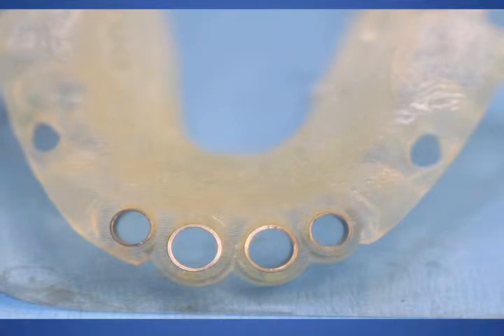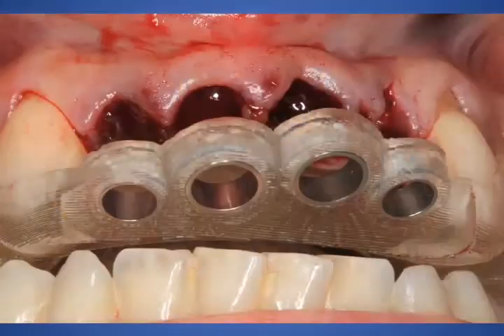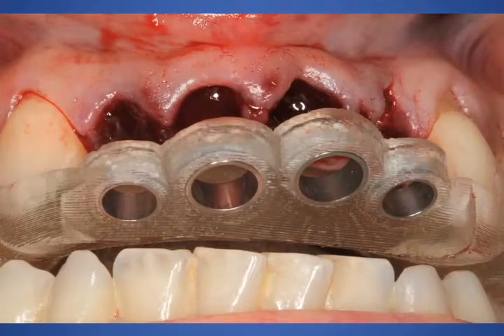You can see the separation that will be created from the implants. We have plenty of room to place the implants in the correct position. Here we're simply placing or snapping in the maxillary surgical guide, again created by the dental laboratory.